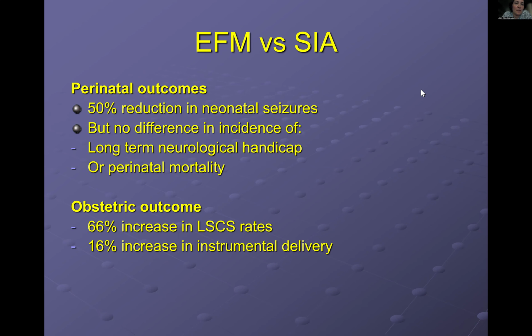But certainly, if you have an abnormal trace, you are kind of bound to act on it. The whole point of today's session is not to say that electronic fetal monitoring is not useful. It's there, it will have to stay, and I don't think it will ever be removed from the labor ward. If anything, it will be modified.